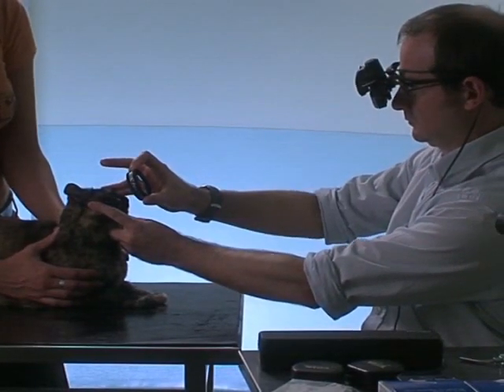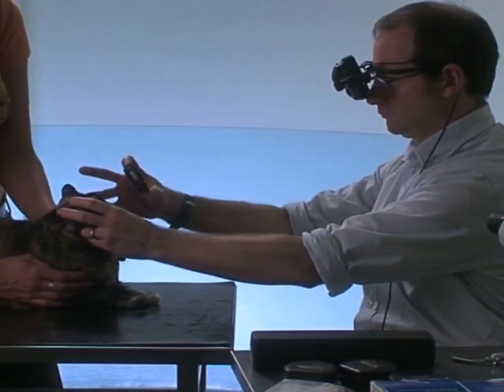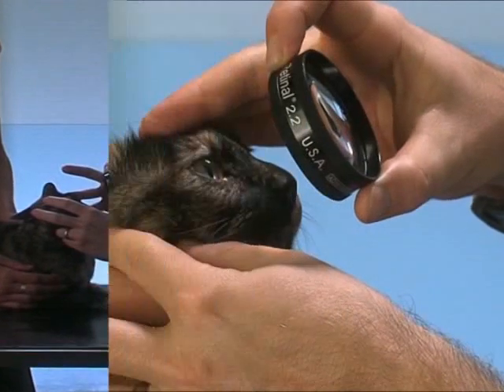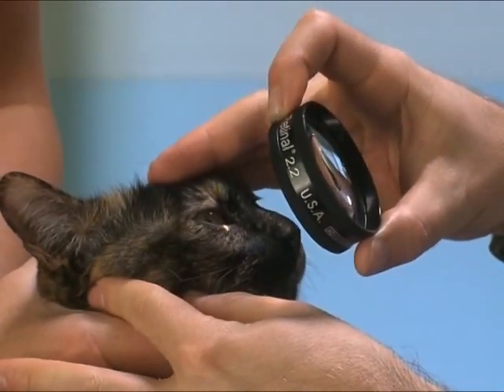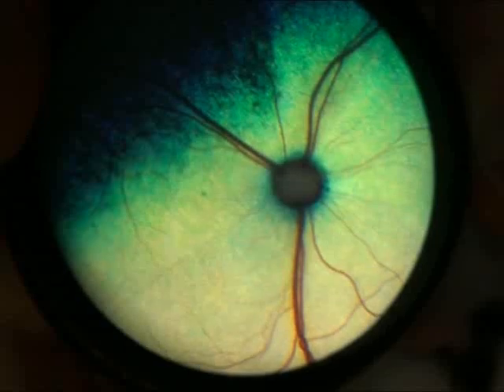The position of the lens is critical for obtaining a useful image. The lens should be held between forefinger and thumb, and another finger used to stabilize the hand against the animal's head. The lens should be centered over the pupil and held parallel to the iris. The image of the fundus should appear to fill the lens.